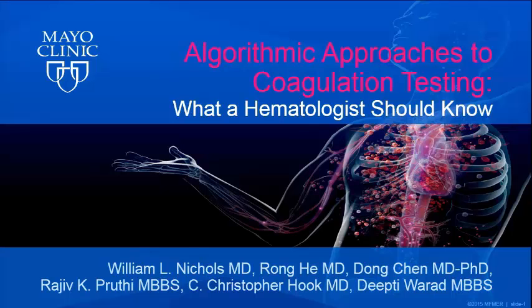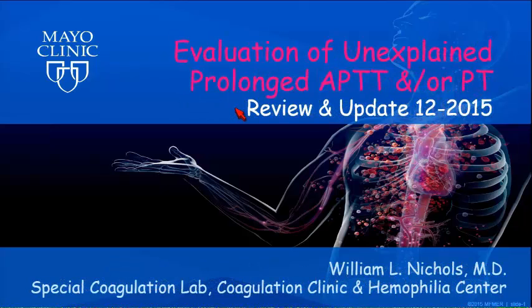An unexplained prolonged APTT or ProTime is something frequently encountered by clinicians. Sometimes the diagnosis is obvious, sometimes it's obscure. Sometimes it's an artifact of sample collection or processing, and our usual approach to that is, if indicated, to repeat the test or repeat the draw and so forth.